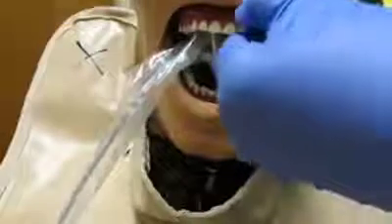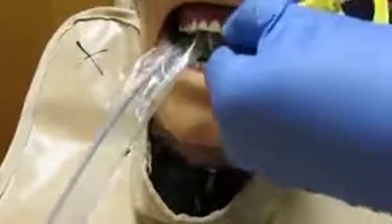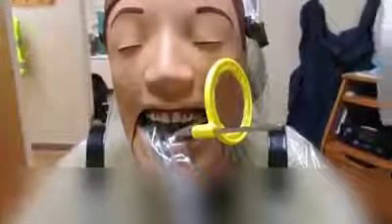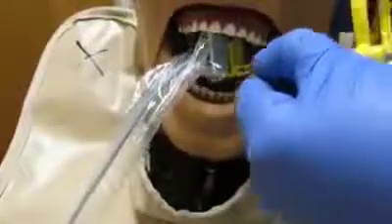Once the maxillary molar exposure of one side has been completed, move to the maxillary premolar exposure of the same side. Center the receptor at the center of the teeth that you are aiming to expose. In this case, at the center of the first maxillary premolar.